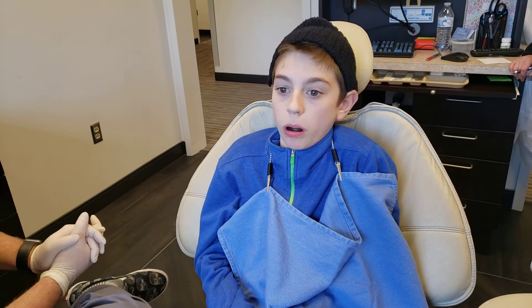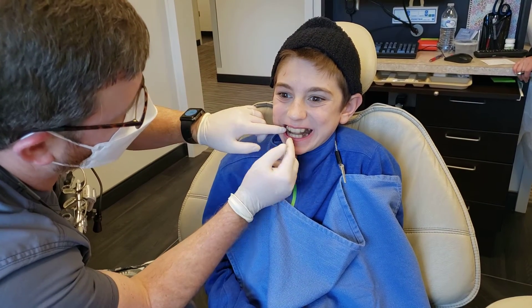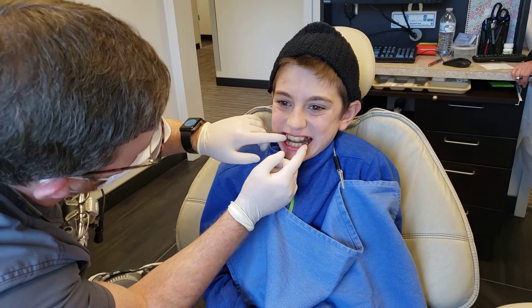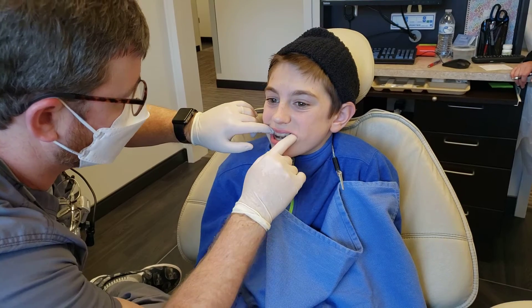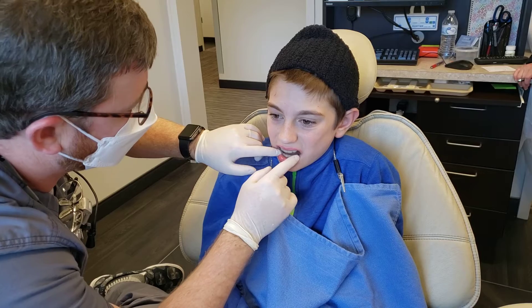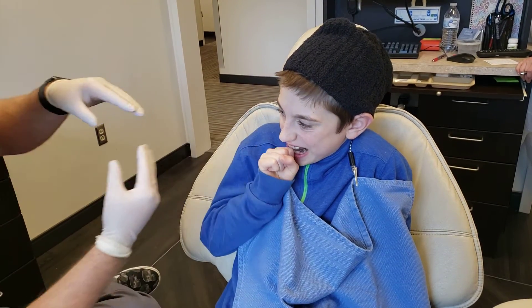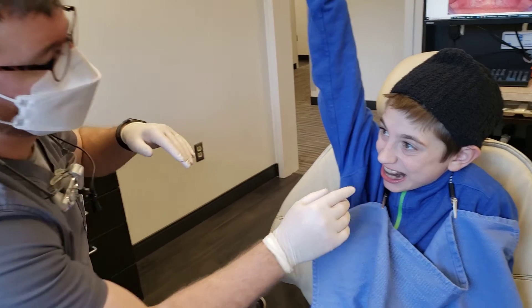You're already squeezing harder than when you first put it in — great. This is going to help guide the eruption of the permanent teeth into an ideal alignment, and it's also going to help the back teeth super-erupt.